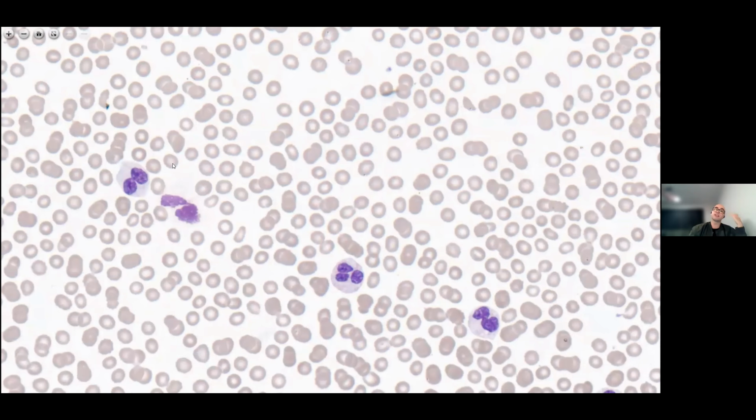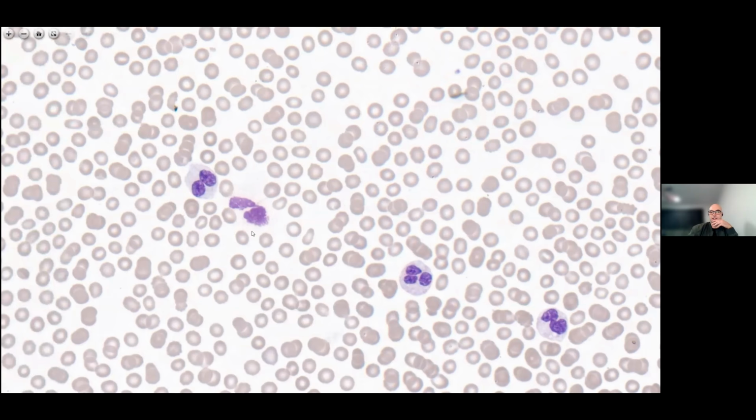If you go too thin an area of blood film, the red cells start to lose their central pallor, and you might be over-calling spherocytes or inappropriately reporting spherocytes. If you go too thick in the film, you might start seeing rouleau formation when it's not necessarily there and not significant. Or you might see what you think is agglutination, then go troubleshoot it and follow your procedure manuals, start warming samples thinking it's cold agglutinins, and waste 20-30 minutes of your time. So it's always good to look at the ideal area of thickness.